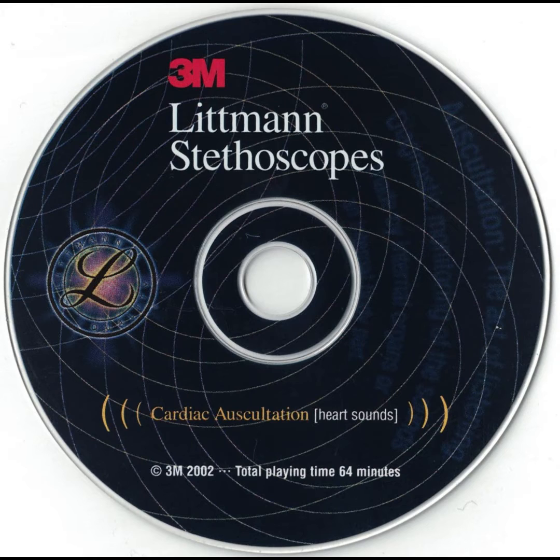Opening snap. The opening snap is a short, high-frequency sound, which occurs after the second heart sound in early diastole. It usually follows the second sound by about 60 to 100 milliseconds. It is most frequently the result of the sudden arrest of the opening of the mitral valve, occurring in mitral stenosis, but may also be encountered in conditions producing increased flow through this valve, i.e., VSD or PDA.